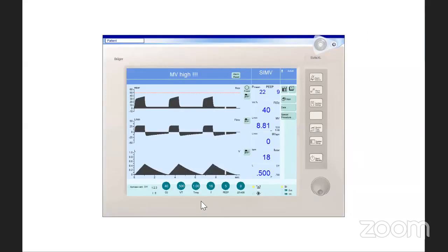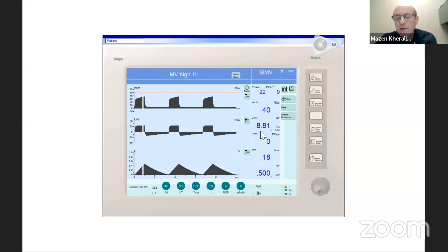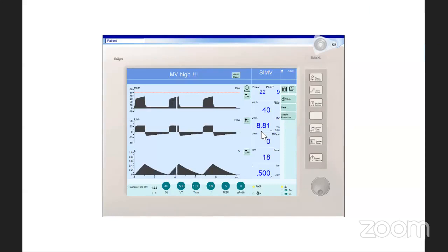So if you decrease the tidal volume, what will happen to the minute ventilation? It will decrease, and I expect CO2 narcosis also. Okay, so is that the most appropriate thing to do at this point, or do you have different things that you can do on the ventilator first before you start decreasing the minute ventilation? And increase the flow to 60 or 80. Excellent. All right, perfect.